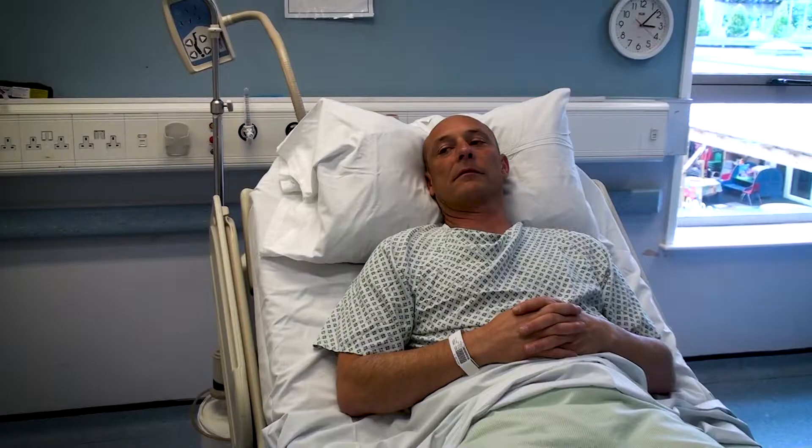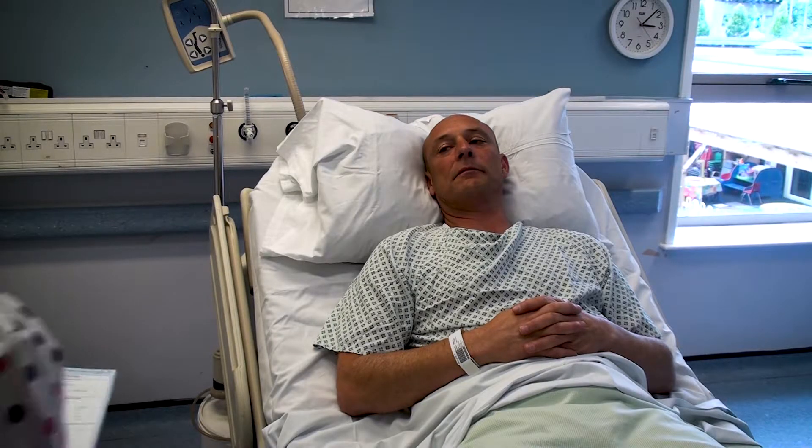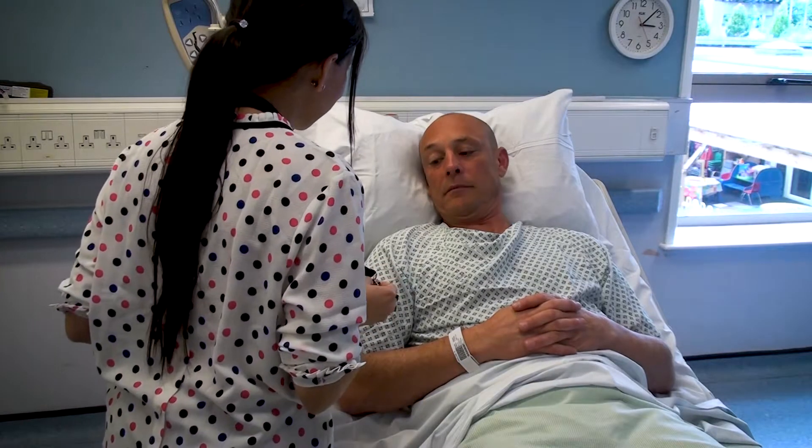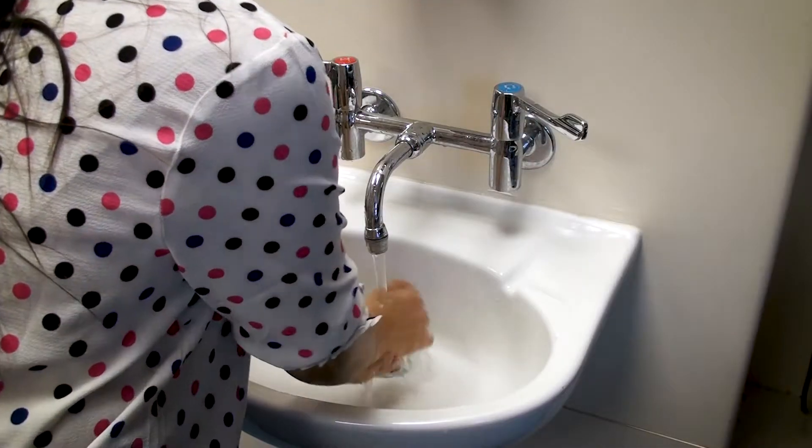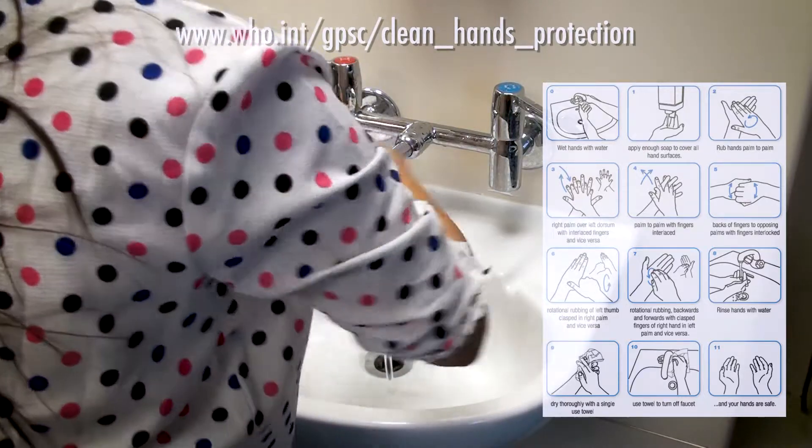Welcome to the clinical skills video for the arterial blood gas sampling from a radial artery. Prior to any clinical procedure on a patient, you must ensure that you have obtained verbal consent from the patient and explained the procedure thoroughly. You must then also ensure that you have thoroughly washed your hands using the 11-stage technique.